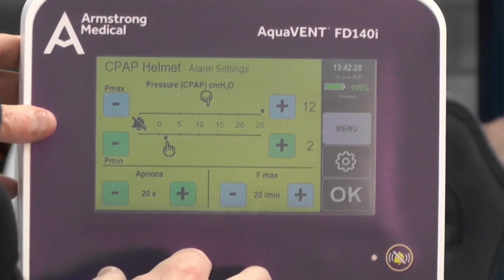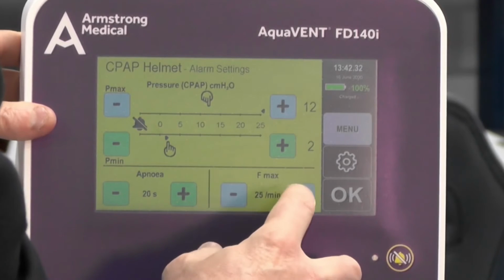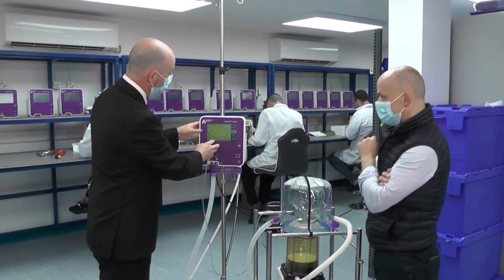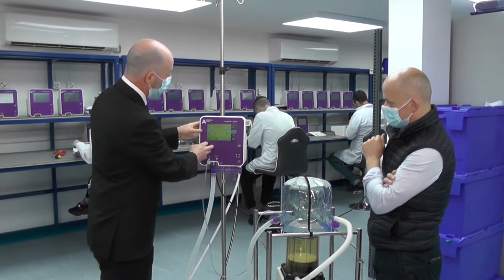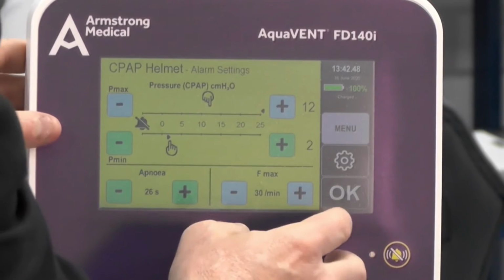The frequency of the breaths alarm is set default at 20, so let's put that up to 30. And an apnea alarm, which is the period it takes until the machine decides that the patient is not making sufficient respirations, that's set at a default of 20, so let's put that up to, say, 26 seconds. And you're now ready to go.